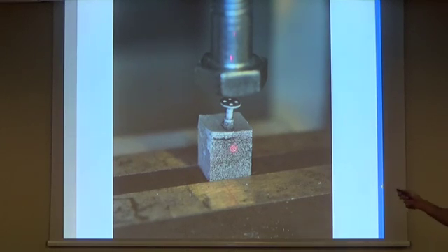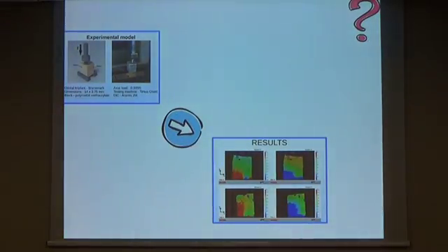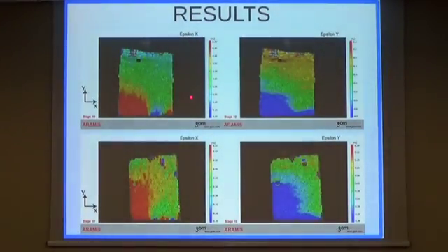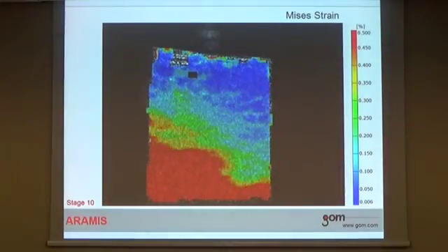The force or loading was applied axially, in 50 newton increments up to the 500 newtons maximum, and here is shown the visualization of strain field in X and Y direction for both surfaces. After that, using this system, we calculate the increase of strain during the loading.